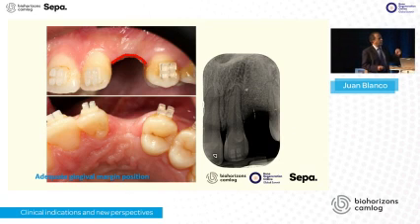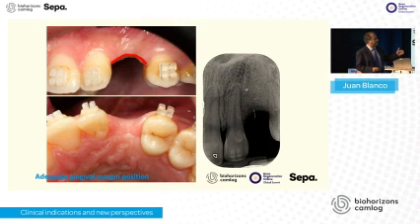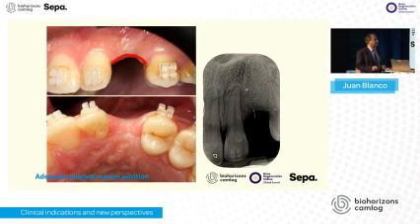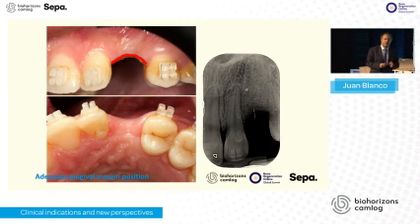And then once these 6-7 months went away, and once the orthodontic treatment allowed us to do the surgery, we proceed today with this surgery that I'm going to show you immediately. I would like to draw your attention to the collapse that we have in the vestibular aspect. An important thing is, how are we going to treat this?